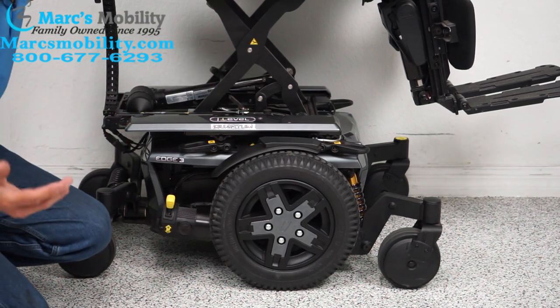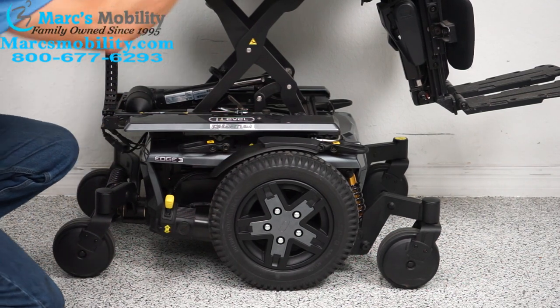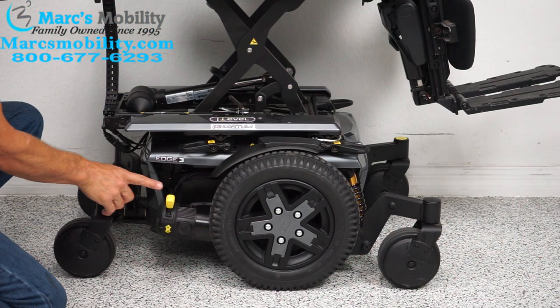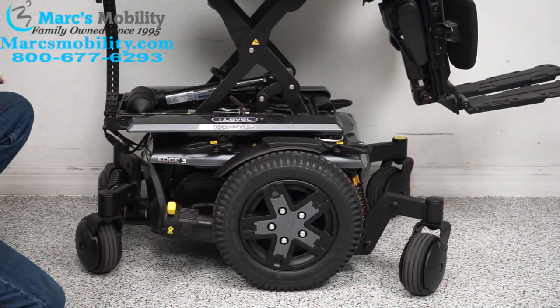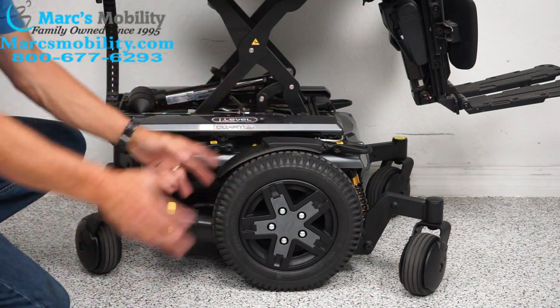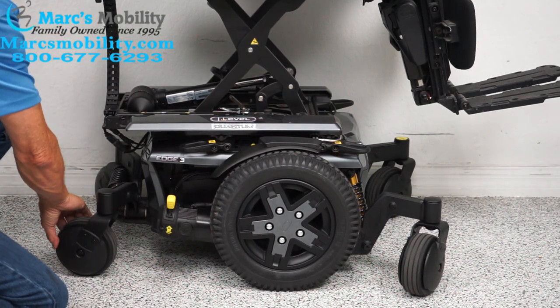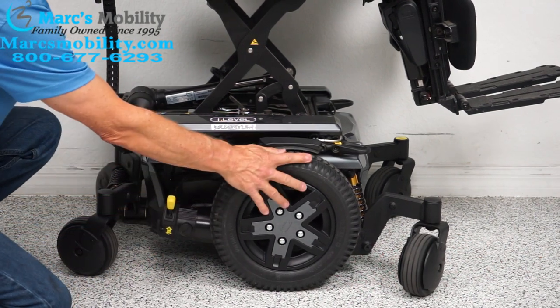If you need to push this chair — say you forgot to charge it or have an issue — first make sure the power is off so there's no resistance in the motor. Then push down the yellow handle to unlock the wheel. Unlock both motors and you can roll the chair in a circle or forward. When you're done, do not forget to put it back in gear. I get a lot of calls the next day from people who left it in neutral — nothing's working. Put it back in gear and you're fine.